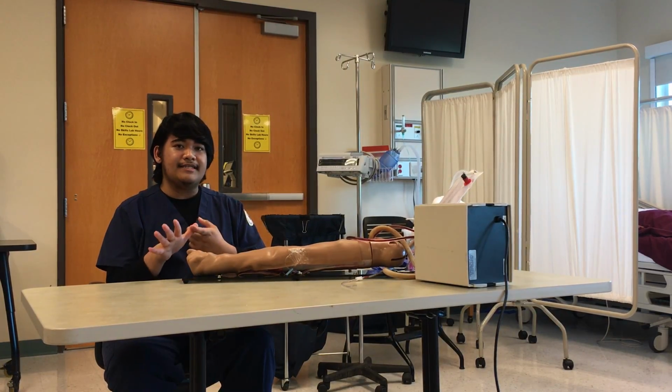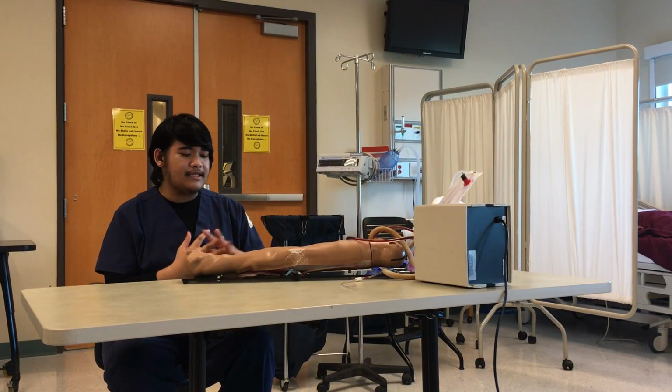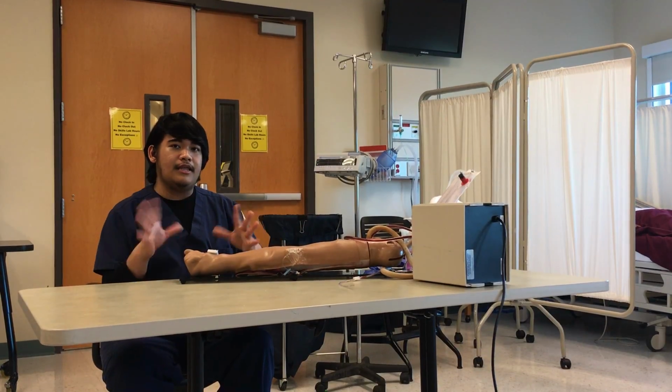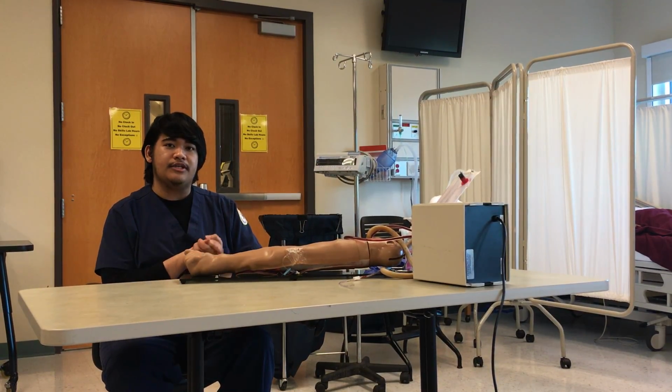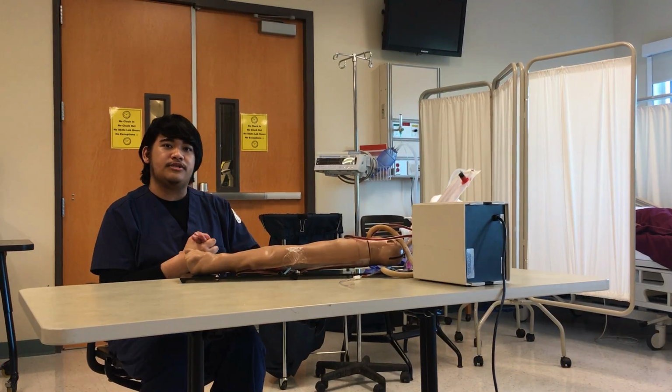I would also check for a negative modified Allen's test, and whether the patient has any grafts on the arteries or any shunting. Those are some of the contraindications that mean we can't do this test on this patient.